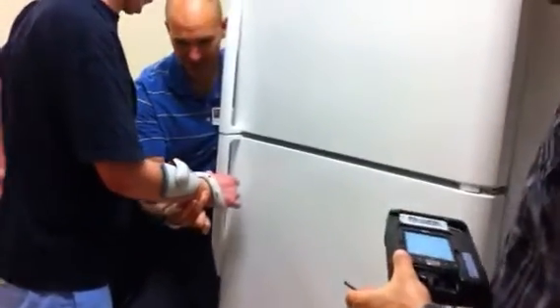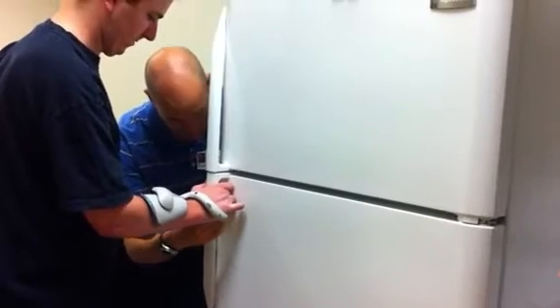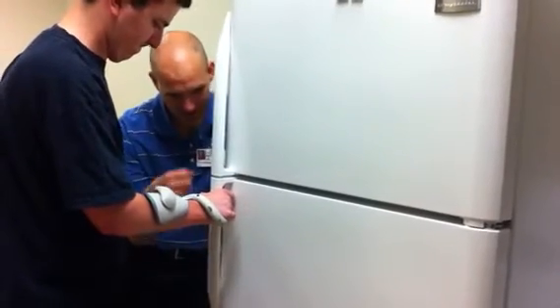Now we get the strobe light. Just let me do something on my side. So we're just not going to get that middle finger in there. So I'm going to assist to see when we get it involved.